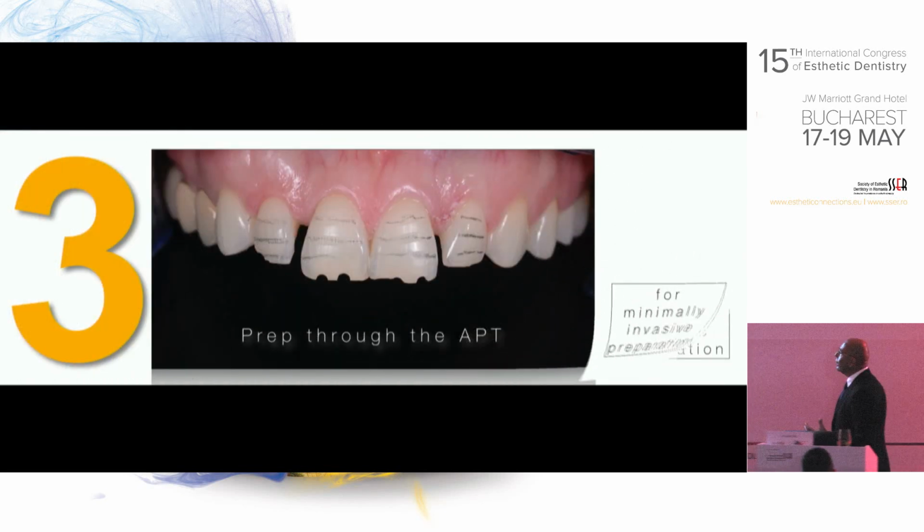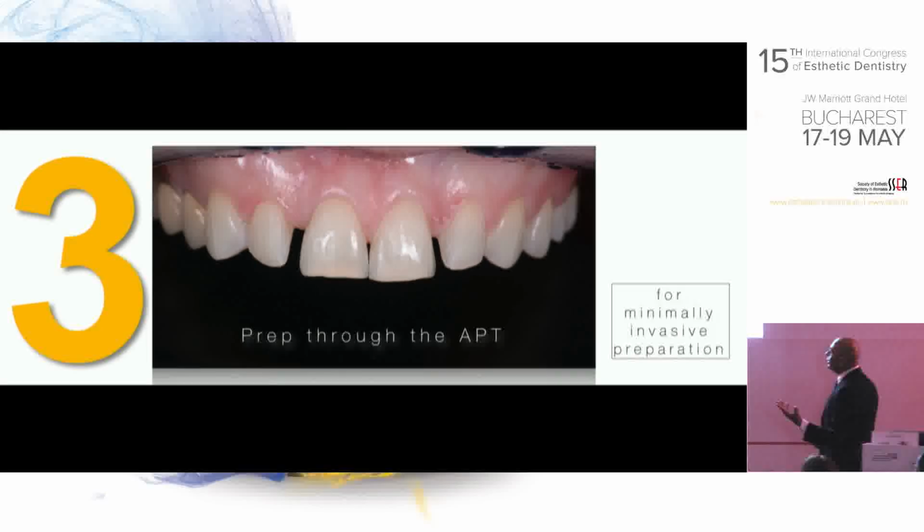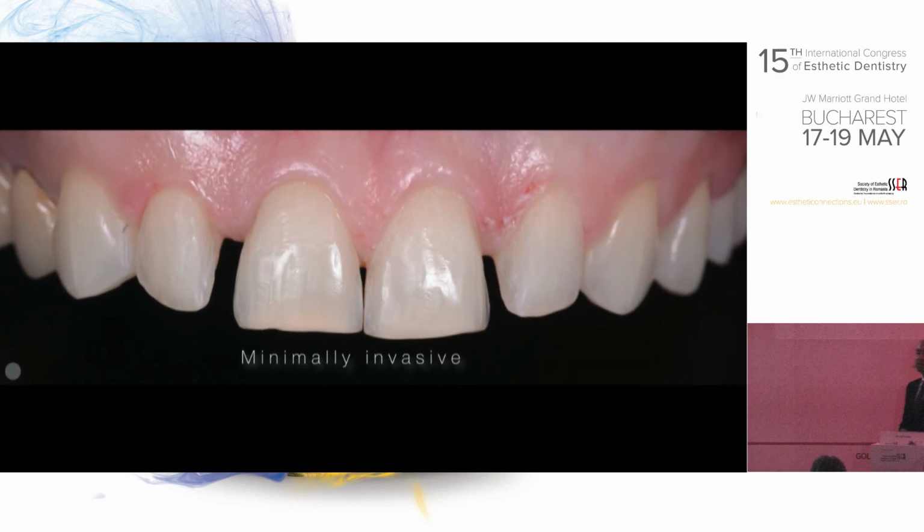So again, prep through the APT, and this is what we get. Truly, truly minimally invasive. All the prep stays on enamel. Why? Because if we leave the prep on enamel, this was the research we published, the success rate goes up to 99%. I'm not kidding. But if you expose dentin, especially in the cervical area, success rate comes down to 68%.